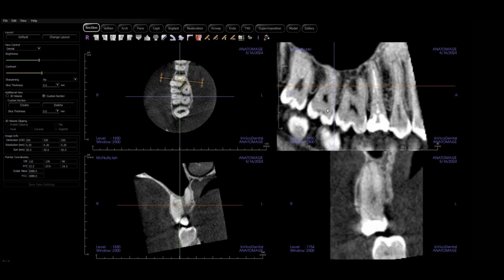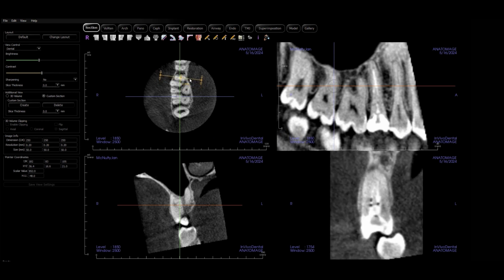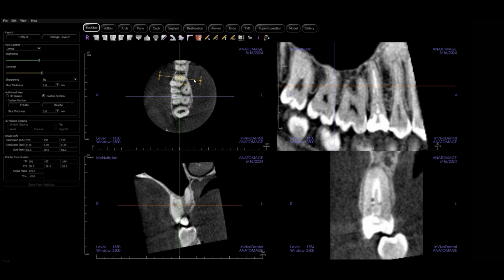The last thing I'll say is when we obturate using these more advanced thermoplastic obturation techniques, I'm finding we don't need a lot of sealer. So what I would recommend, and we've talked about this in the past, but I think it's worth reiterating, I'll put in sealer, and then with a paper point I really go up and down and I'm trying to coat all of the walls the best I can, but then I'll follow it up with 4 to 6 paper points to pull out as much sealer as I can. With modern obturation methods, we're using thermoplastic gutta-percha to go everywhere, not sealer. Sealer, unfortunately, is still being taught to be placed in the way that it was placed back when cold lateral condensation was the primary method for obturation.